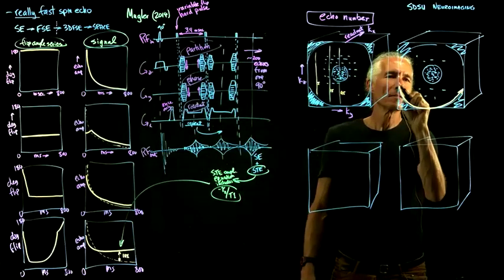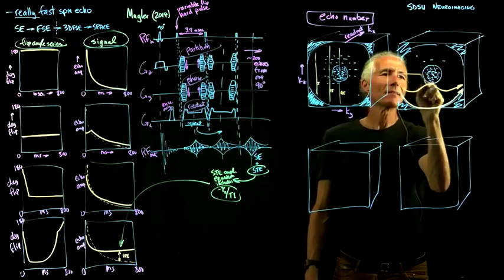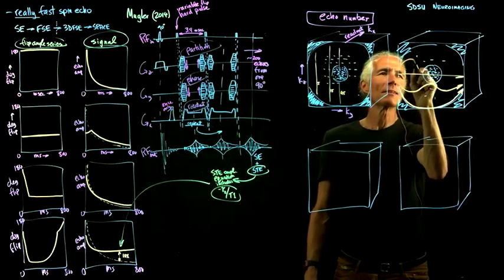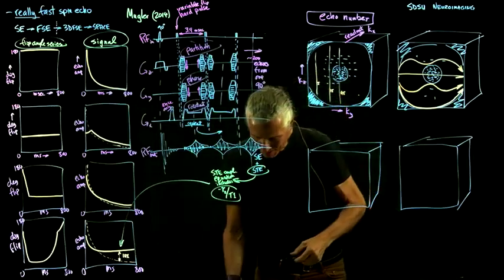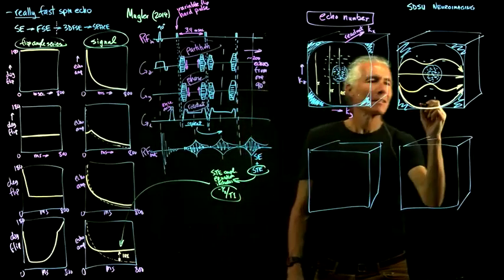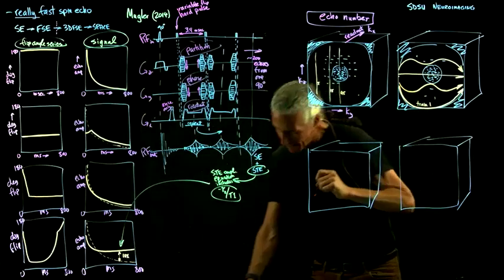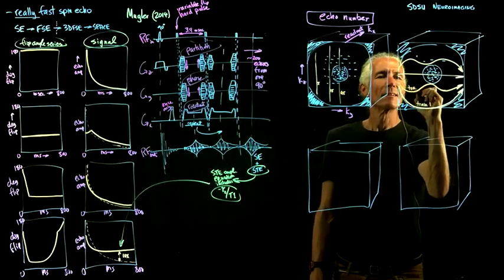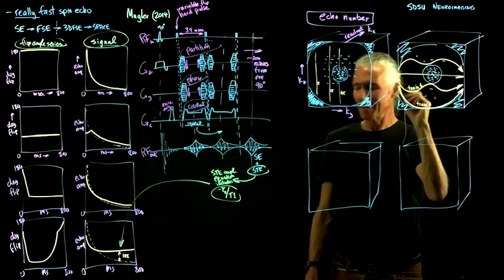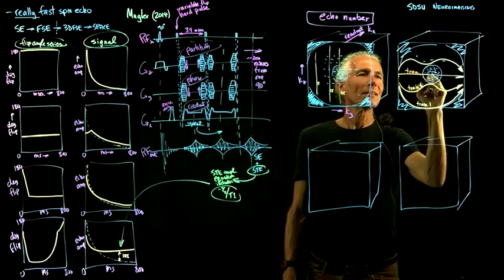But then, because we're more dense, we've got to go through a little bit differently, depending on where we were. So this is like echo train 1, and then that one up there is like train 6. This one is going through the middle, train 16, etc.